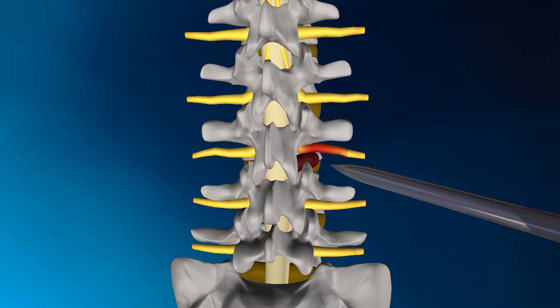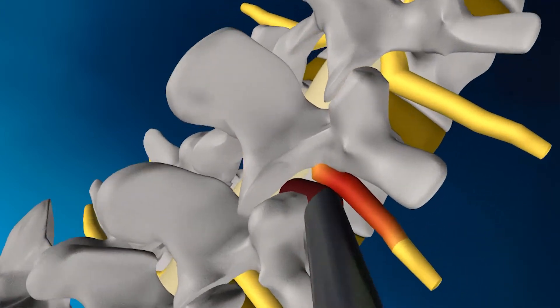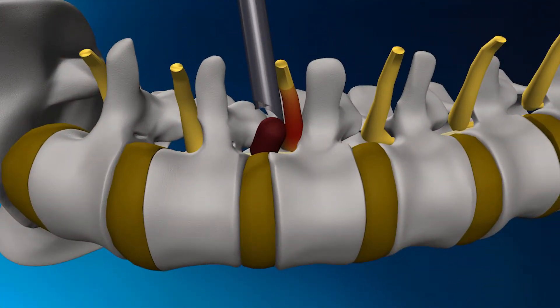After the dilator has been inserted, a cannula or working channel is placed over the dilator. When the cannula is in place, a working channel is created to access the herniation, which can then be accessed without resecting any bone or muscle.